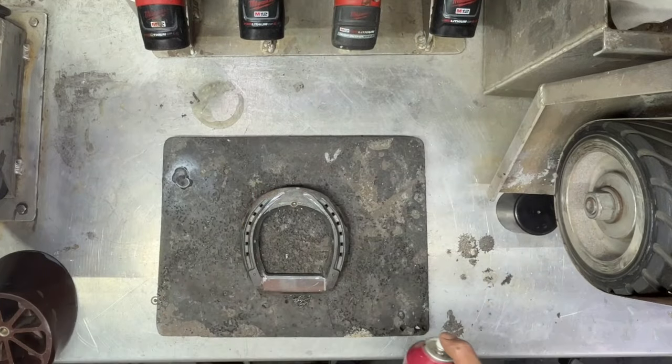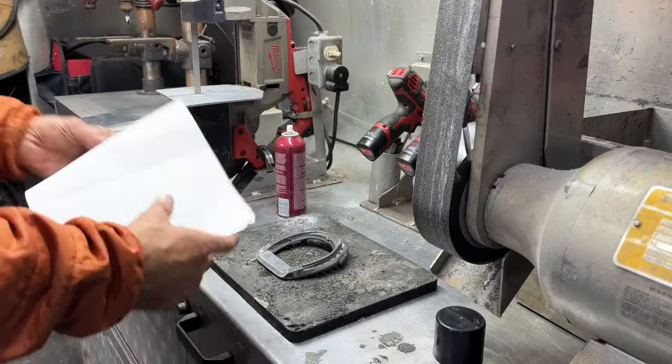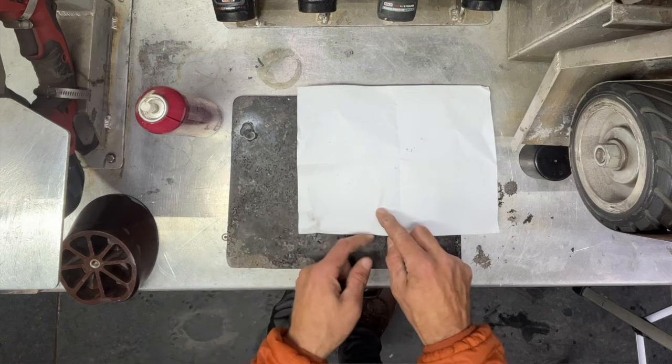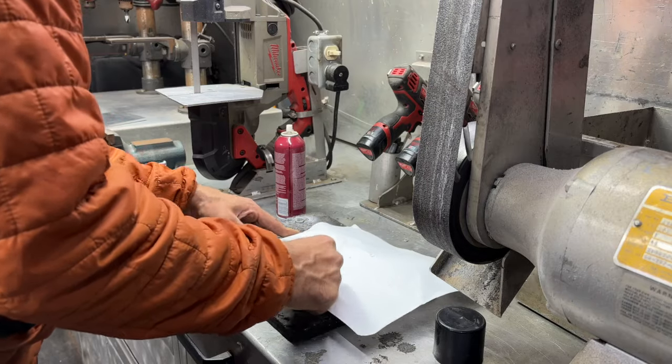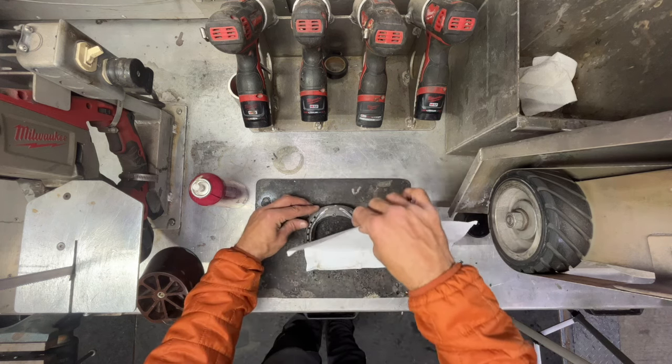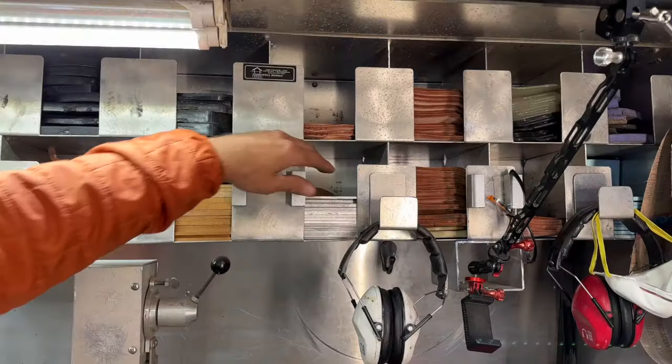I then used some 3M adhesive to spray on the heels of the shoe so I could attach a piece of paper to the shoe and it would not move around. You can now do a rubbing or an imprint of the inner rim of the Avanti shoe. This will end up giving you the template for your plate.